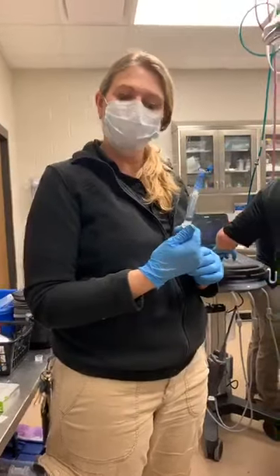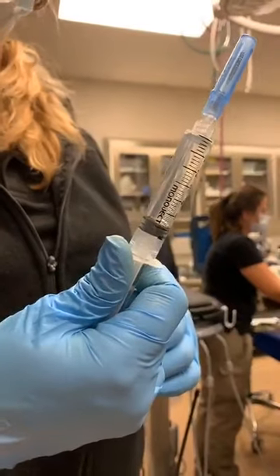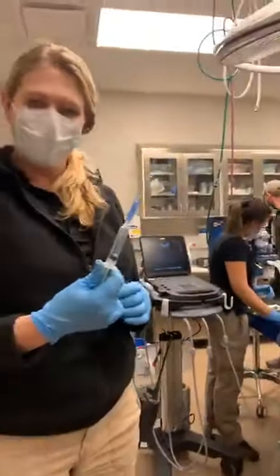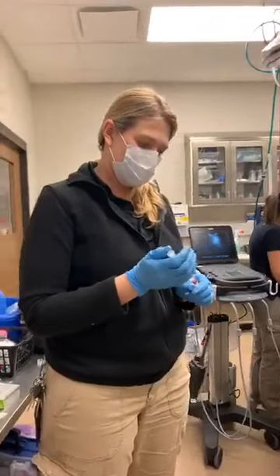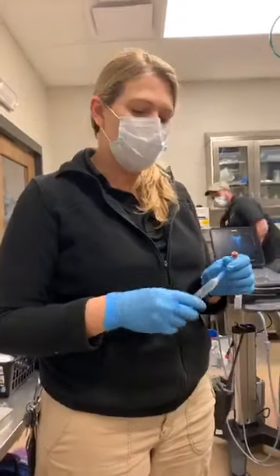Okay. And it's pretty clear. You know how they always say your urine should be pretty clear, that says you're hydrated? Looks like he's well hydrated today. Yeah. Alicia asked, what would the bladder look like with fluid other than urine? Well, like if there were blood or something like that, or infection material.